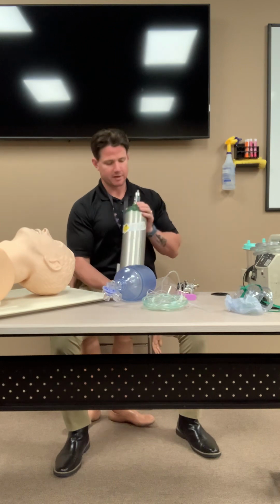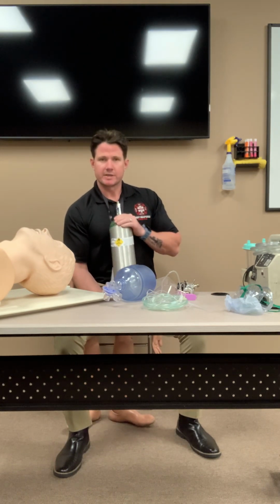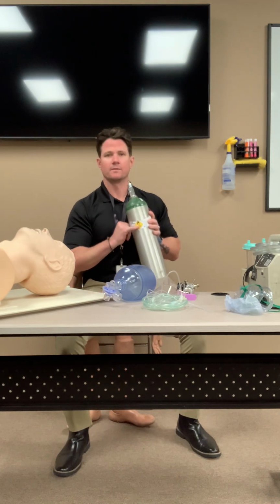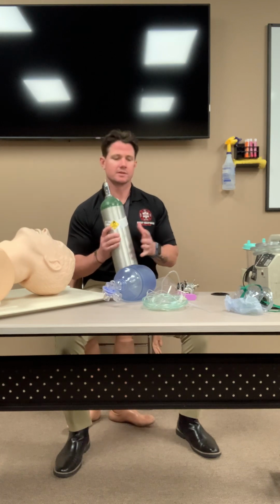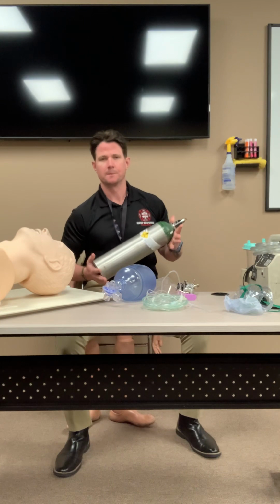Next thing I'm going to confirm is that it's oxygen. I know it's oxygen because it has a green top, right? It says oxygen on it. It should have a US Pharmacopoeia label on it. If it does not, no sweat. These oxygen tanks are a little bit old. We use them quite a bit around here, as I'm sure you guys know.